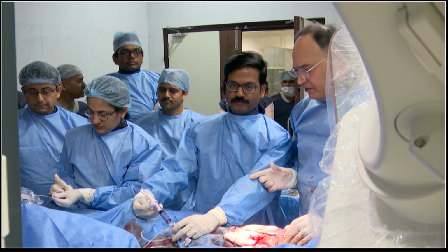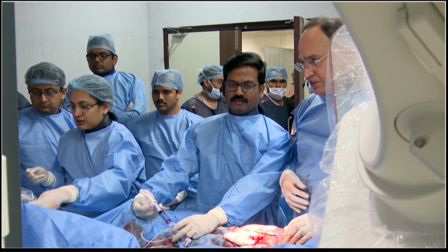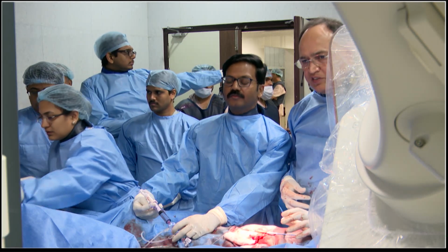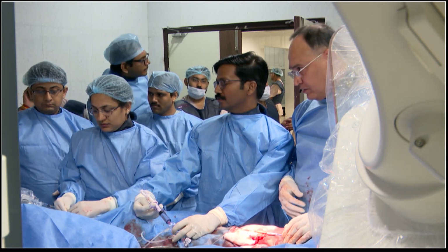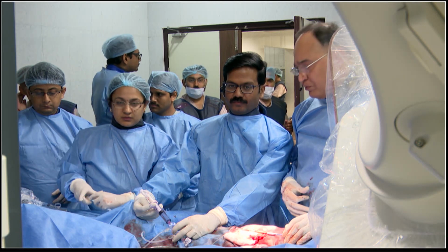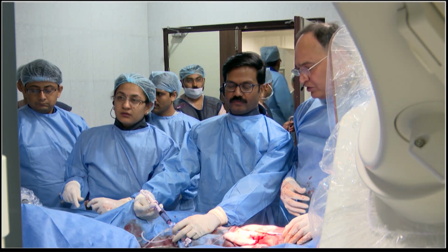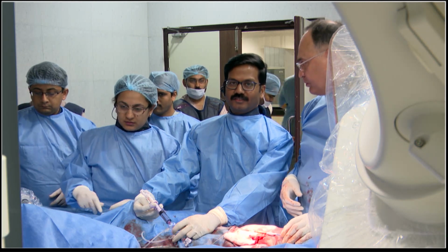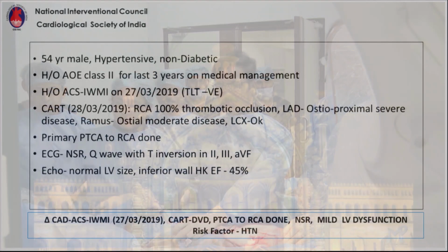So I'm going to have my colleagues here present the history, and then we're going to show you the angiogram, and then we'll discuss our strategy and get some help from some of these excellent moderators. We'll tell you what we have done so far. With your help, we'll be able to finish the procedure. So go ahead and tell them about the case. Can we have slides, please?